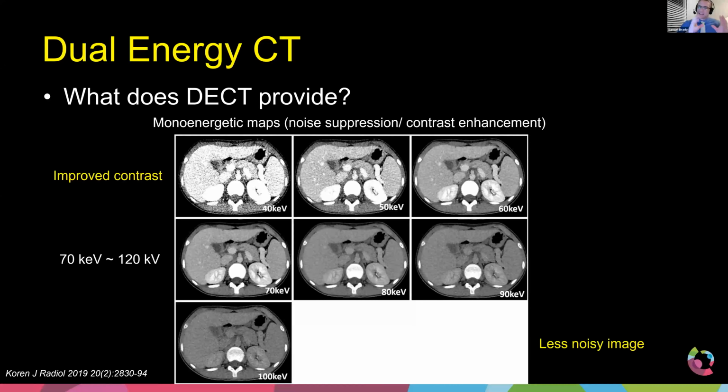And that's why, like I said, there are some hospitals here in the US that are moving all of their imaging to dual energy. It's just because these monochromatic images can look a lot nicer. So I hope that makes a little more sense.